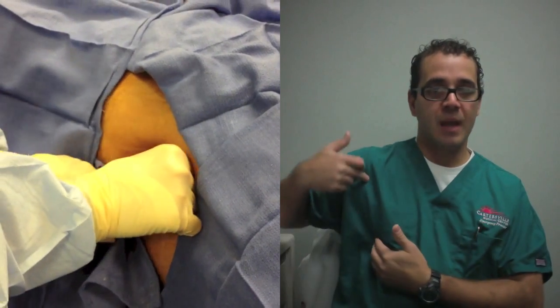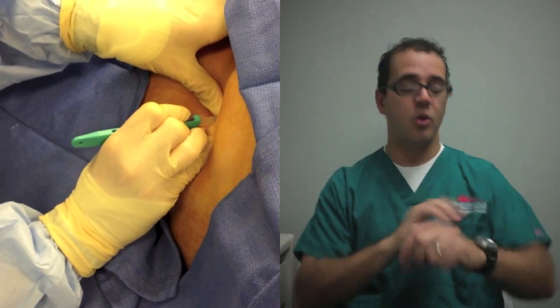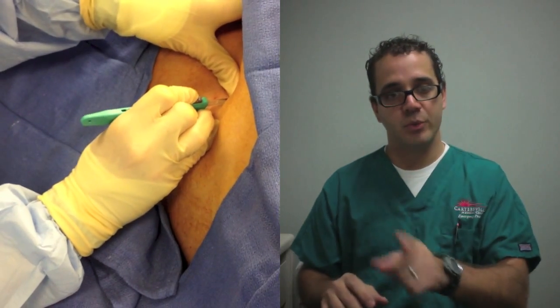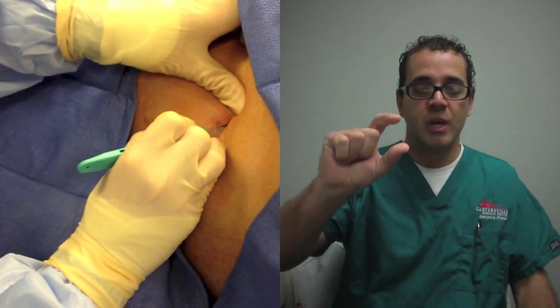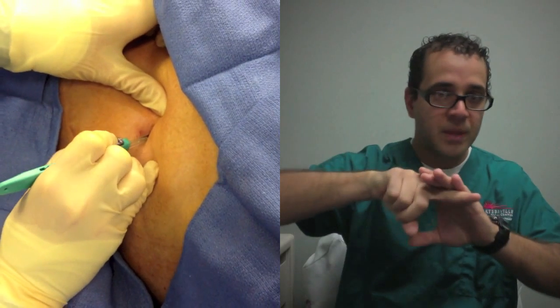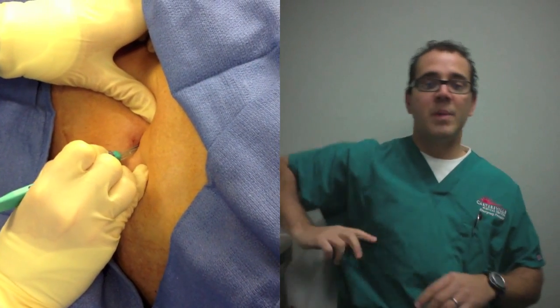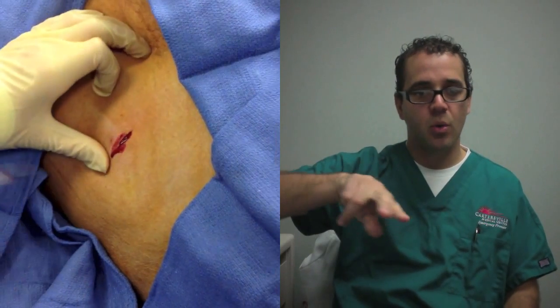The point is, be careful about the side issues — that's why it's so important to get it on the right spot. Nipple line, anterior mid-axillary line — that's where you're going to feel the ribs, and that's where you're going to do your cut. You're all sterile, you're all gowned up, you've cleaned the area, and you have your position. You're feeling the patient's rib and you know to cut there. You're going to cut about two inches or so, enough that you have some space to get your finger into the chest wall and feel the spaces. You want to be able to feel the ribs, so you might have to do some blunt dissection. Some people are very fat so you've got to go through all that fat to feel the muscle; some people are very thin and you'll get right on.